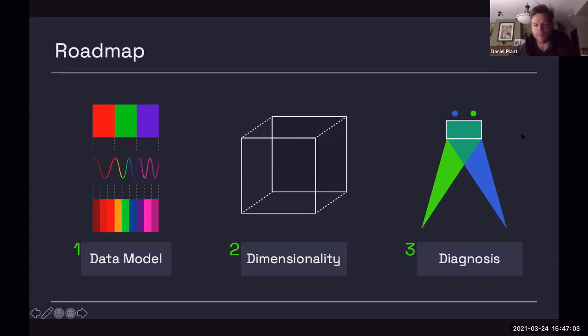And then over time, as we refine the dimensionality issues and improve our data model, maybe as a second stage, once we've identified very clearly which spectral bands are relevant, we can move into multispectral. And we build the data model in such a way that it can accommodate that, and it can also work with, say, smartphone photos or traditional RGB camera and dermoscopic images. We really want to build a comprehensive data model that can accommodate all of this data.